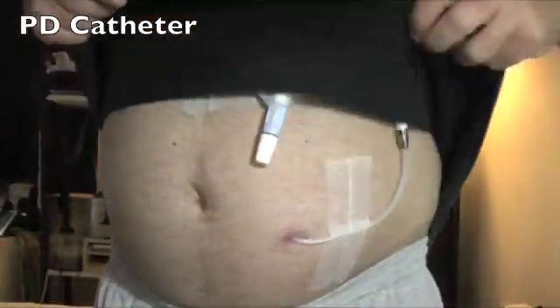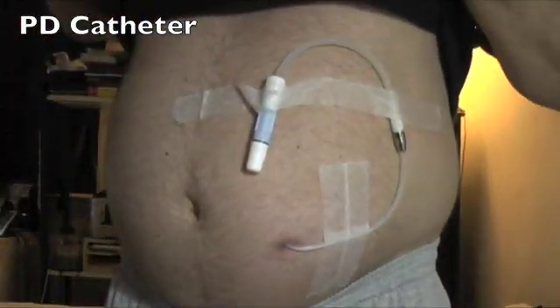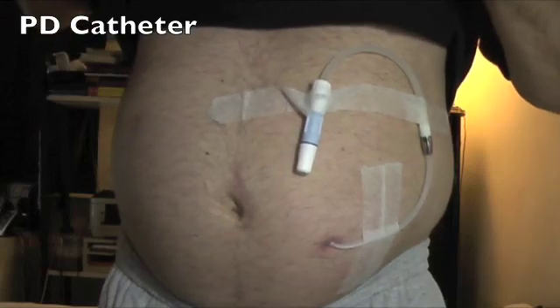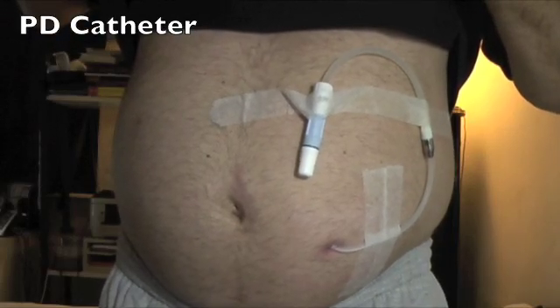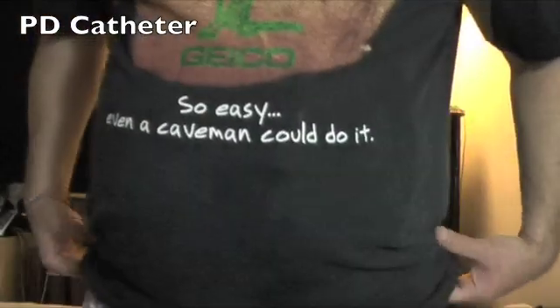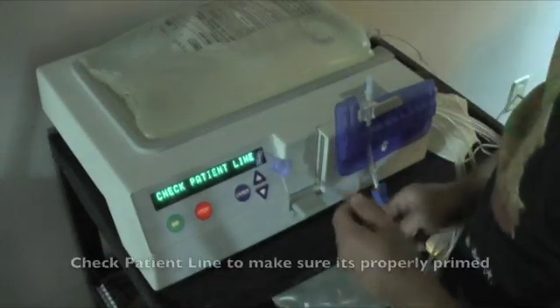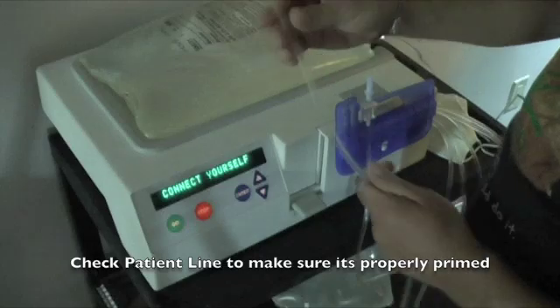This takes a couple of minutes. Here's an example of what a peritoneal dialysis catheter looks like — it goes right into you, and I have it taped up. It looks like everything is primed up now, and it's ready for me to connect up to the dialysis machine. I'm going to check the patient line to make sure it's primed properly.